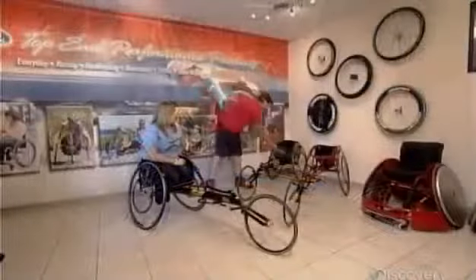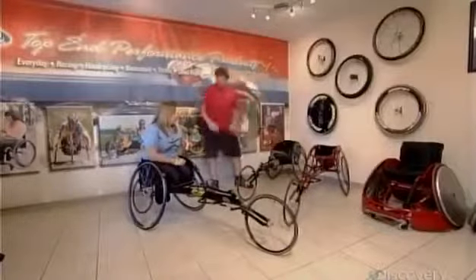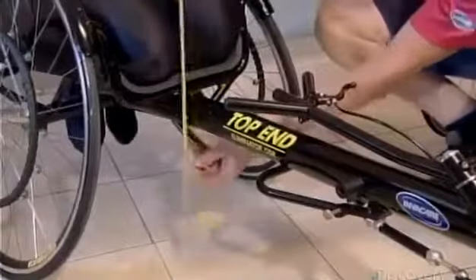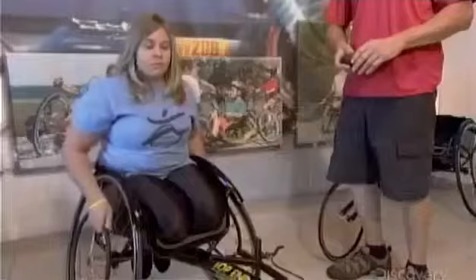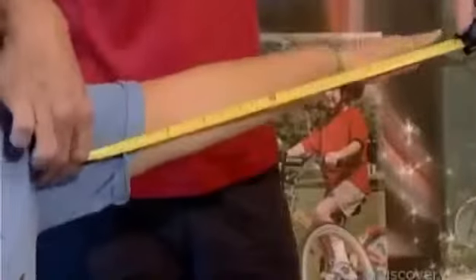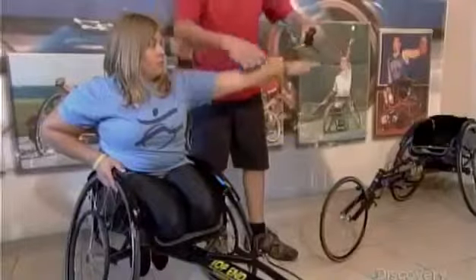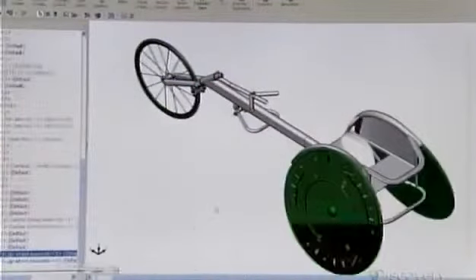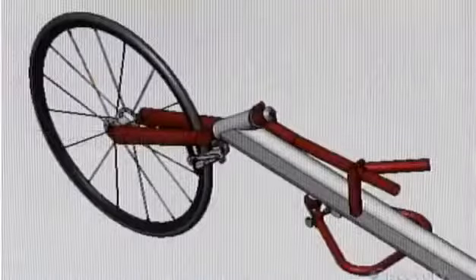They begin by taking detailed measurements of the athlete as she sits in a demo chair. They measure the width and height of her knees to determine the best seating position. They check the balance point to decide how the rear wheel axle should be positioned. And they measure her arms so push rims can be sized for her. Then they produce a digital drawing of the racing wheelchair, complete with any extras requested by the athlete.